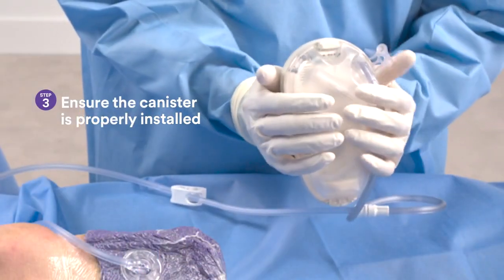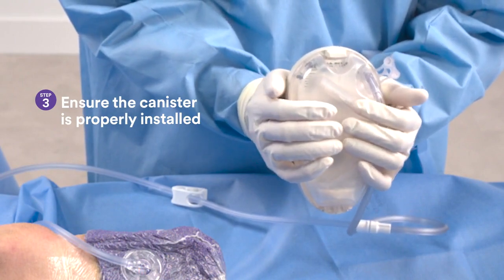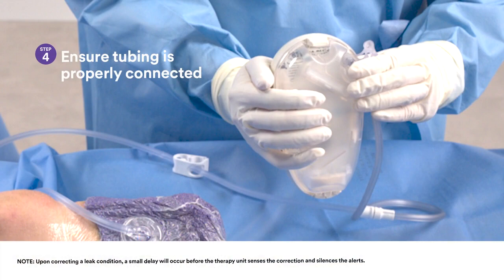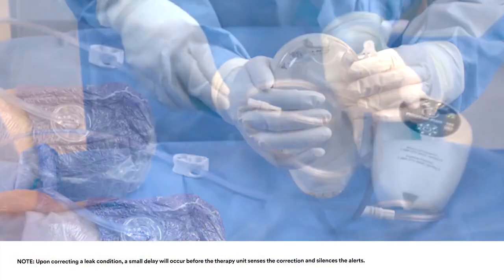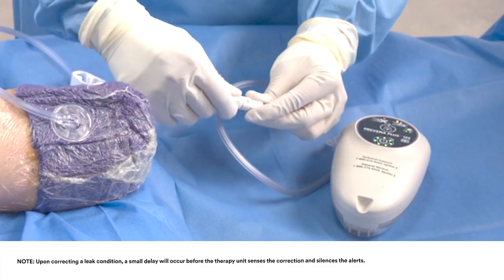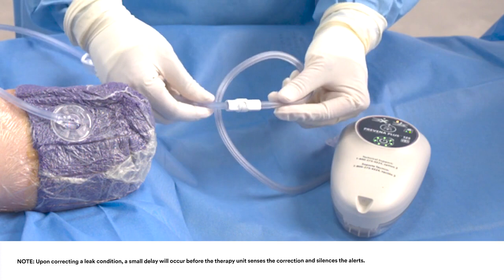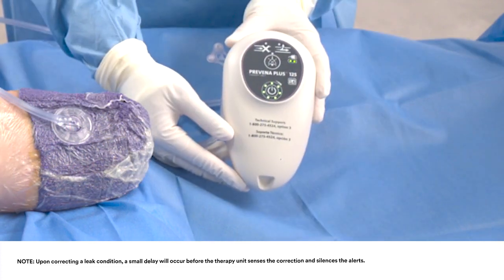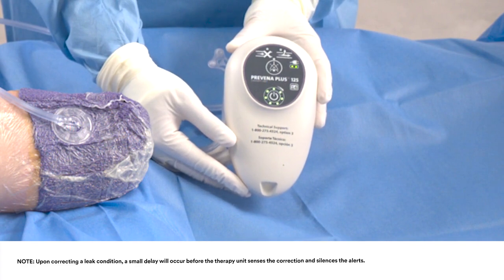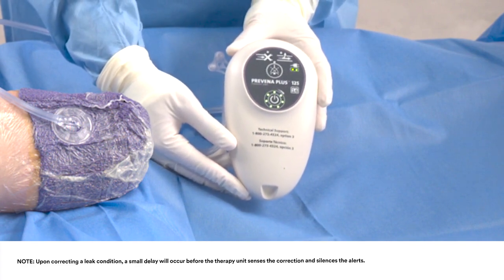When canister is installed, a distinct click will be heard indicating it has been properly installed. Check to make sure the dressing tubing is properly connected to the canister. Check the tubing connectors to ensure that they are fully engaged and locked. Upon correcting a leak condition, a small delay will occur before the therapy unit senses the correction and silences the alerts.